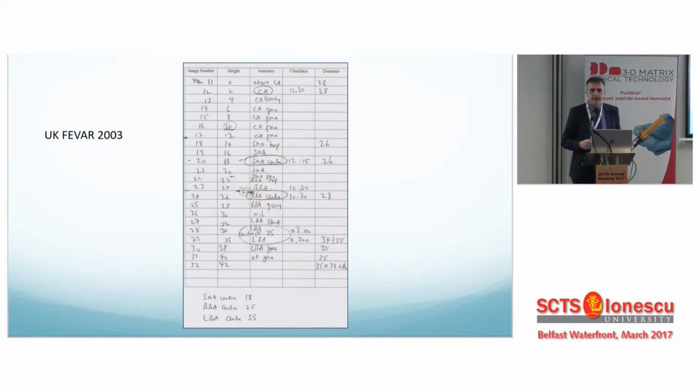We did the first UK fenestrated case in Liverpool in 2003. I couldn't find an image from the case, but this is one of the plans for one of those cases in 2003, and it was a laborious process of measuring, making the measurements to allow us to plan the device to fit the anatomy.